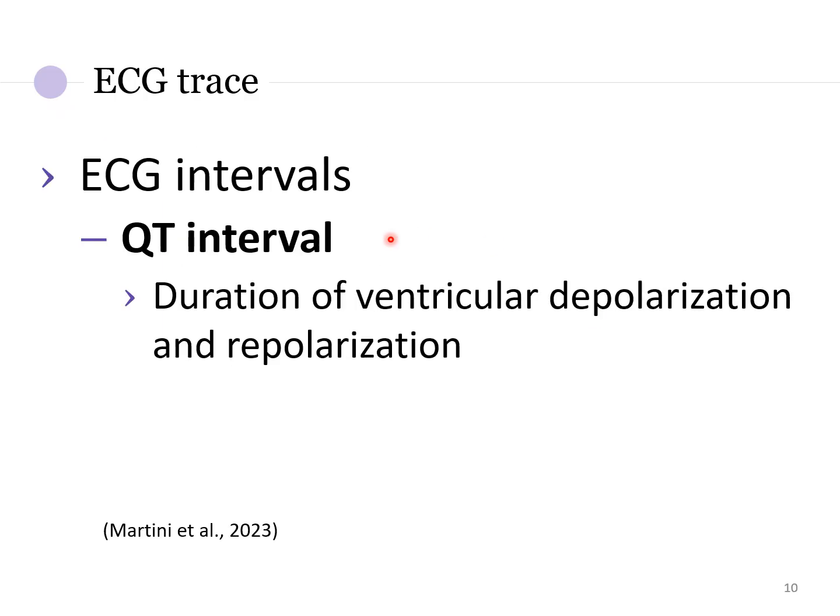All right. There is the QT interval. The QT interval shows ventricular depolarization and repolarization.